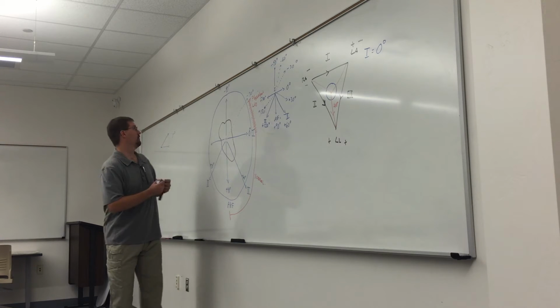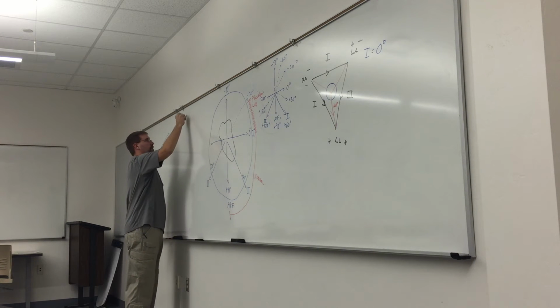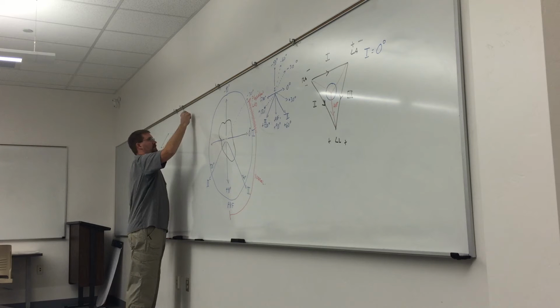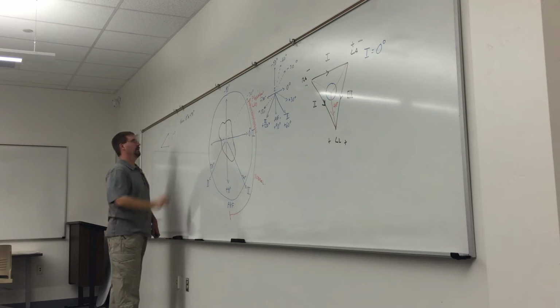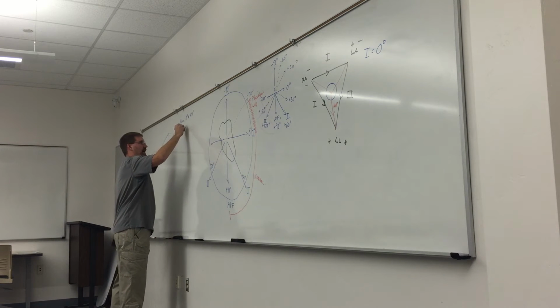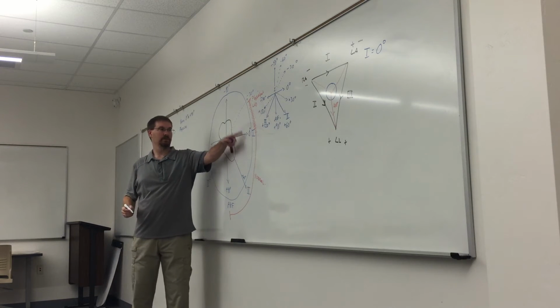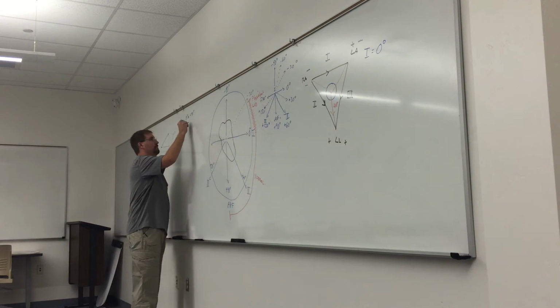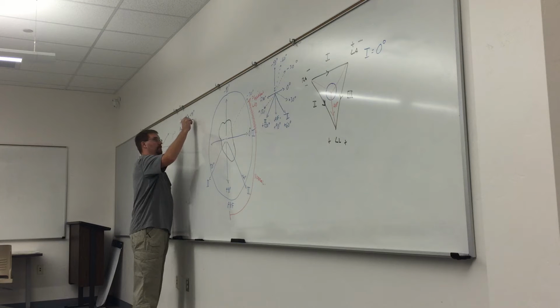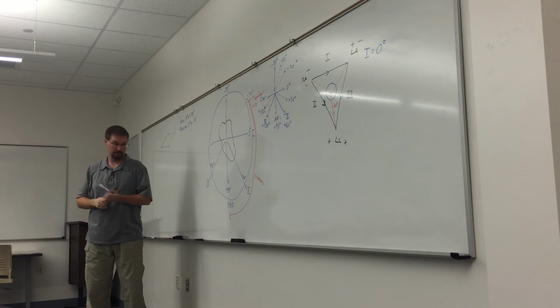Everybody okay? Maybe I'll just write. So perfect normal is from 0 to +90 degrees. All right. Physiological left axis deviation is from 0 to -30. You guys cool with that? So far, so good? Okay, cool.